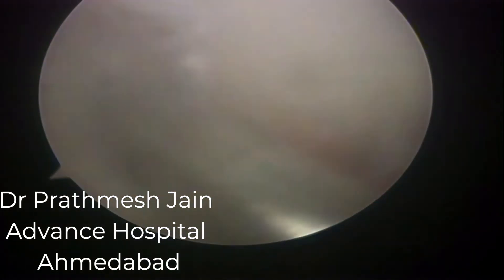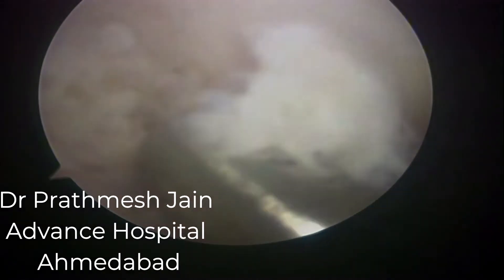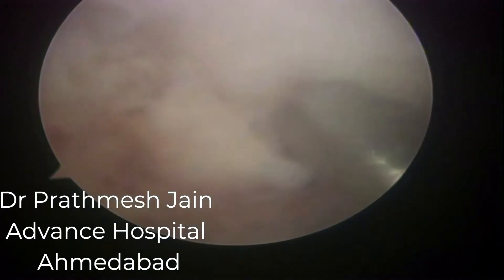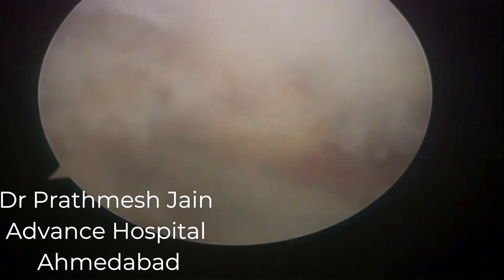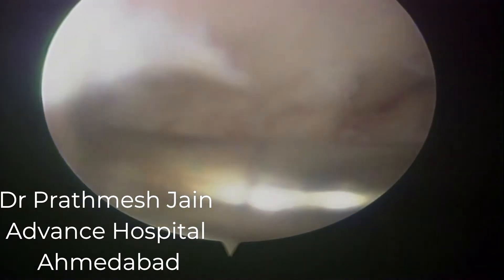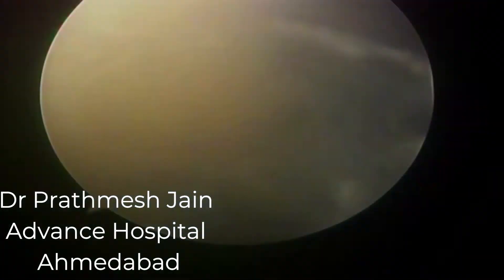Here we can see that there are very dense adhesions inside the knee joint. The whole intercondylar notch area was filled up with very dense adhesions which were very tough to release. I technically use a five millimeter shaver blade in these cases to make the resection faster.